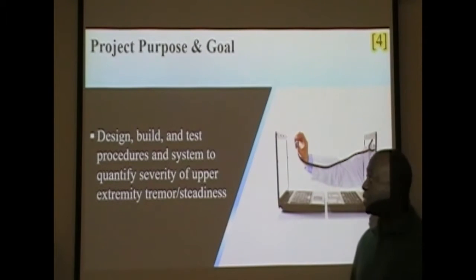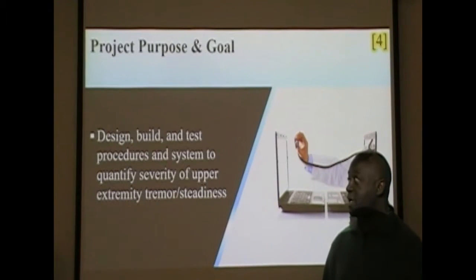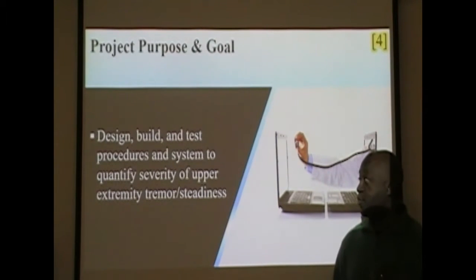So the purpose and goal of our project is to design, build, and test procedures and systems to quantify the severity of upper extremity tremor or steadiness.